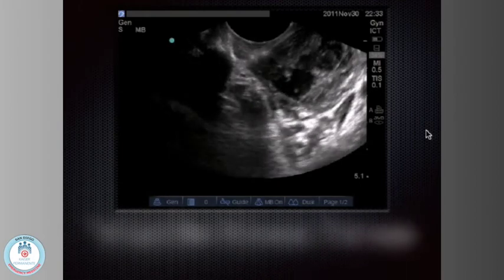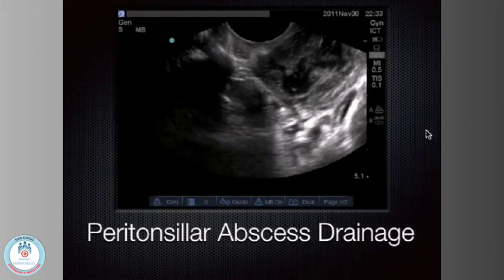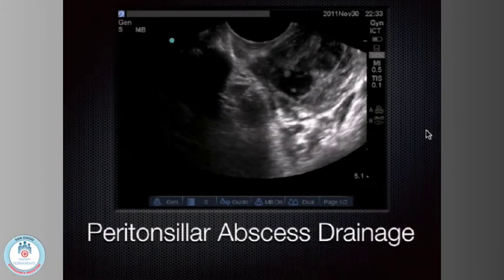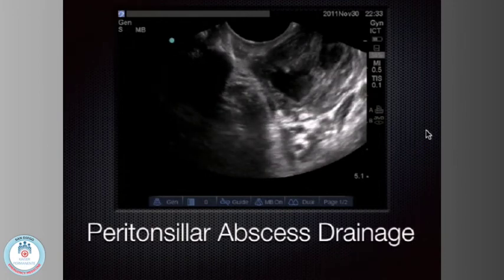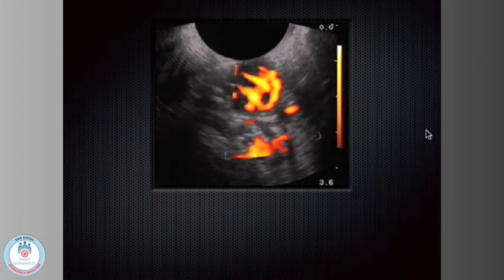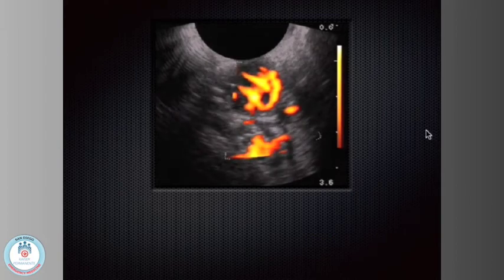So guided procedures when you're using the long axis like that is nice because you see both the tip and the shaft of the needle at the same time. And I think that's better than being out of plane and just seeing the tip or the shaft. But when I teach novices, it's really hard to get them to do any procedure where you've got the needle and the sound and the vessel all together in the same longitudinal plane. It's easier to have them be out of plane with the probe initially, but eventually I think we all have to migrate into this longitudinal in-plane technique.